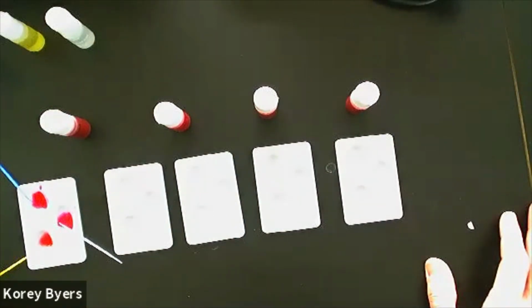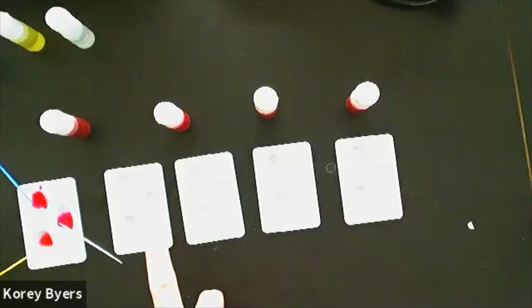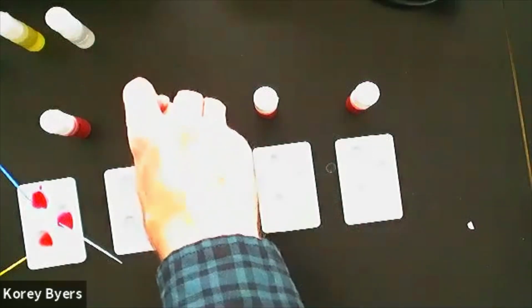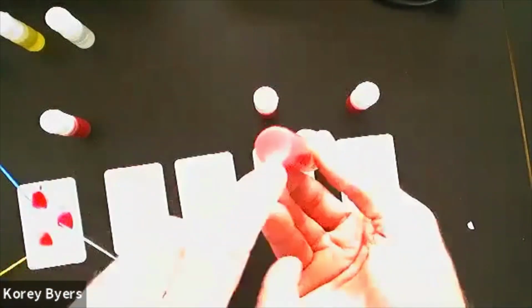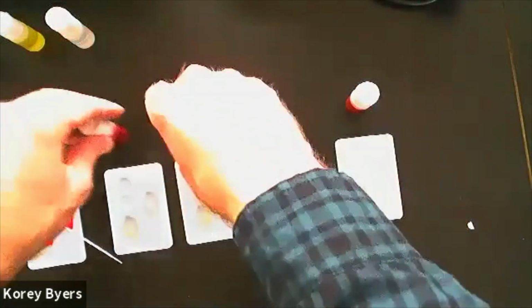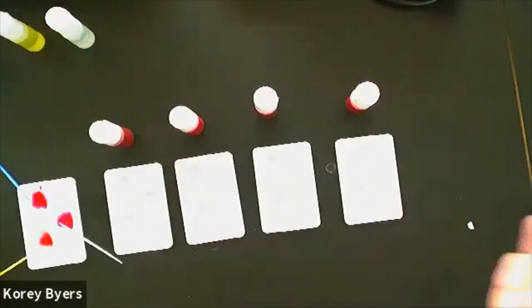The RH serum sometimes takes longer. And so you might have to let it sit for a second and then stir it if it is going to clot. Sometimes these samples are old and we just have chunks of old blood that look like clots but aren't really. So what I'm going to do is, after we've gone through and you go through each of them just like that, we'll talk about it and I'll give you the right answers.